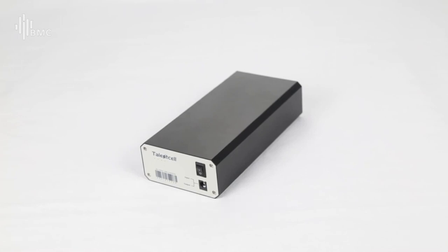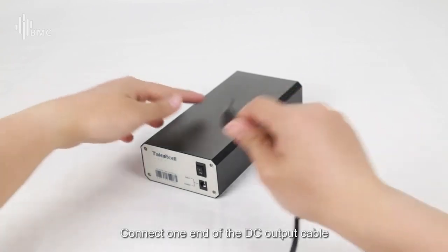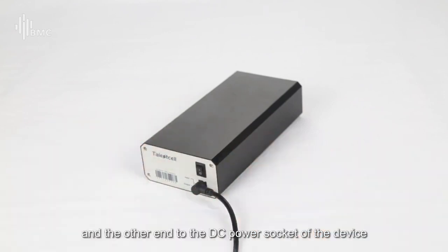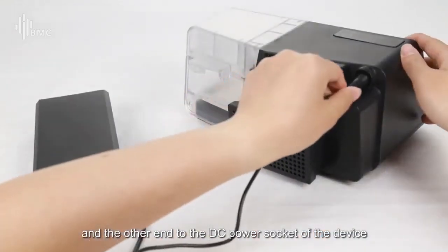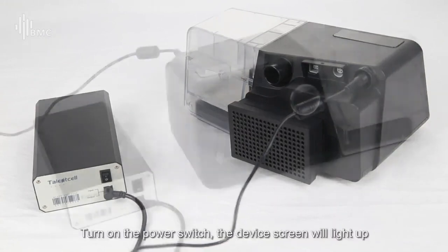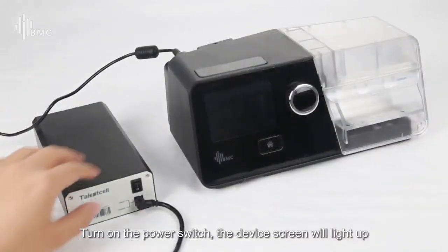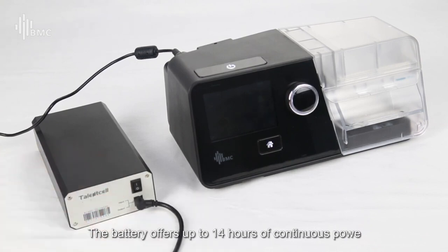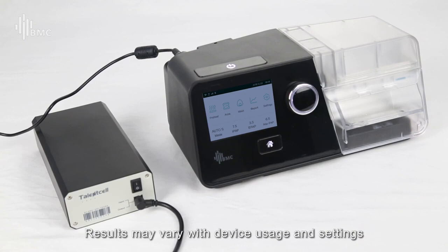External battery. BMC offers a specially made external battery specifically for the G3 device. Connect one end of the DC output cable to the input-output port of the battery and the other end to the DC power socket of the device. Turn on the power switch. The device screen will light up. The battery offers up to 14 hours of continuous power. Results may vary with device usage and settings.